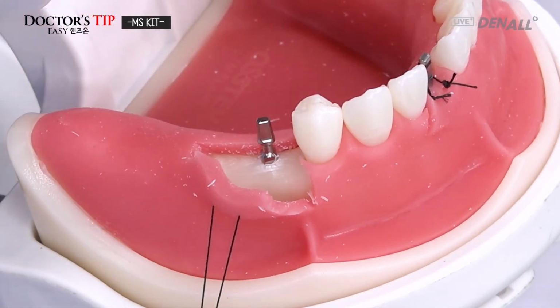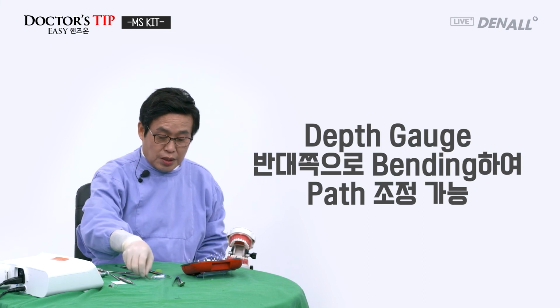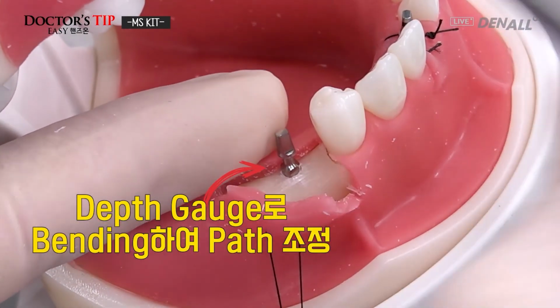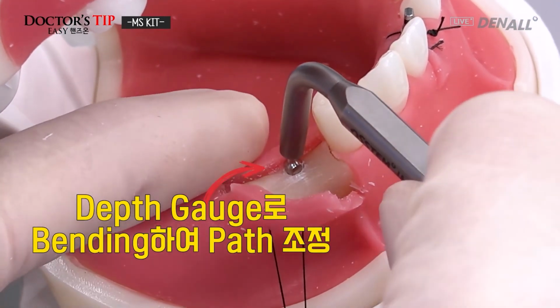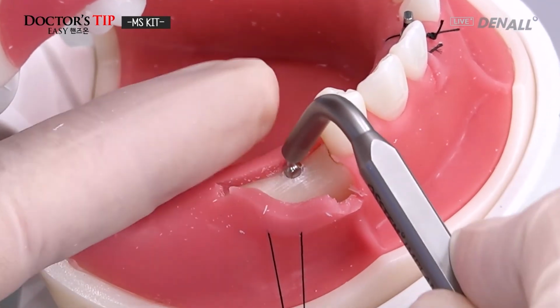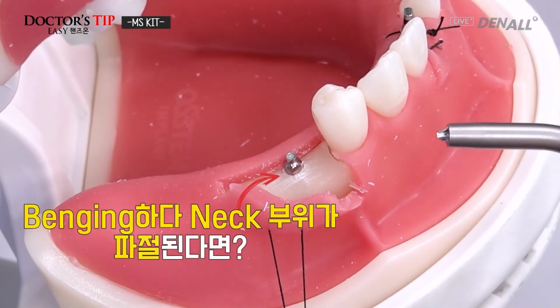And like this, in case of provisional, if the path is not correct, the backside of the depth gauge can be used. For provisional implant, if you don't like the positioning, then you push in depth gauge like this to bend the implant to the position that you want. Like this. Again, it's bendable.